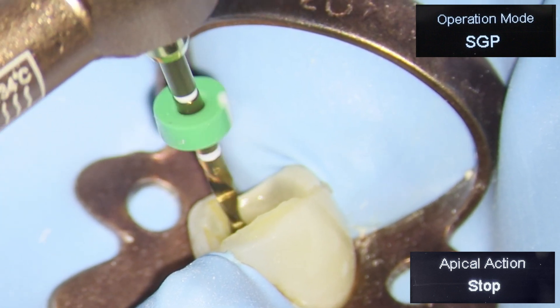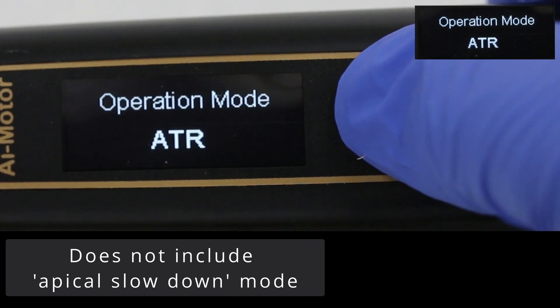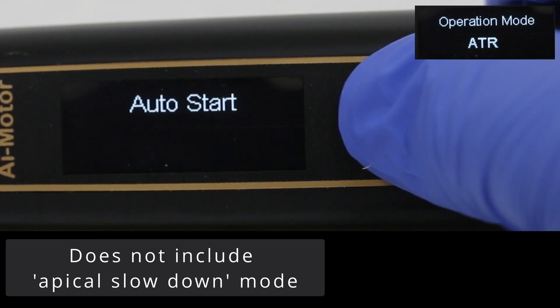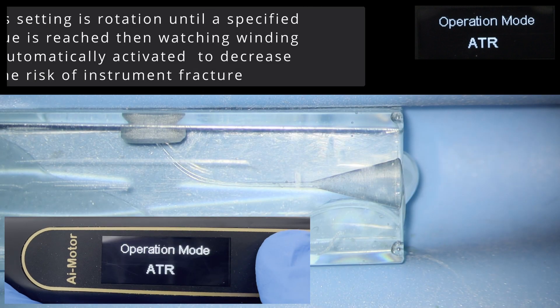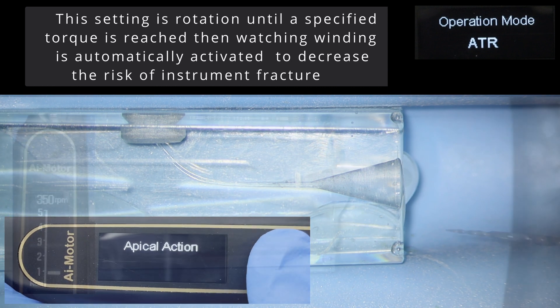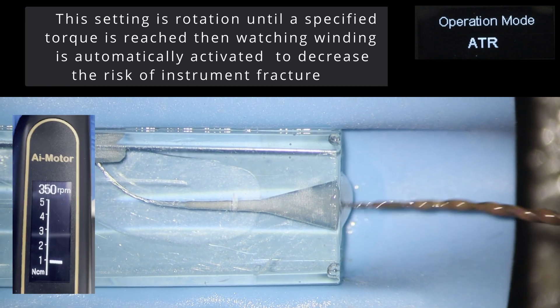Apical action stop can also be activated in SGP. Another operational mode is ATR, which stands for adaptive torque reverse. It is used for rotary files — when a specific torque is reached during rotary motion, the movement switches to a predefined reciprocating angle, designed to reduce the risk of file fracture with rotary files. Unlike SGP mode, however, the reverse angle has limited adjustment. To demonstrate ATR, I'm using a plastic block with the torque setting deliberately set quite low at 1 Ncm — notice the clockwise rotation until the torque is reached, then 90 degrees forward and 90 degrees reverse is activated.